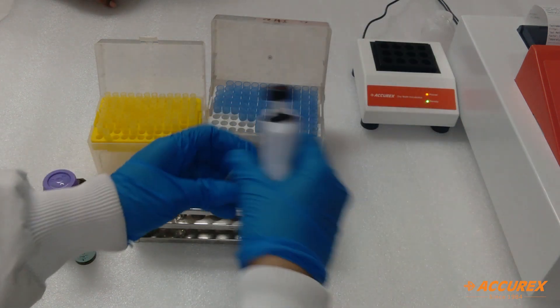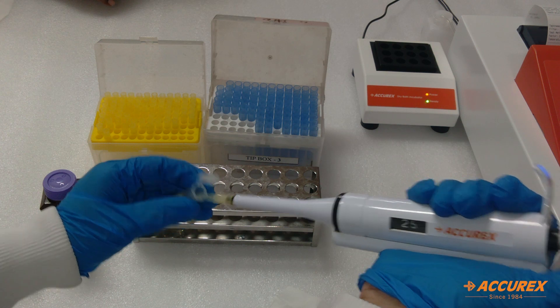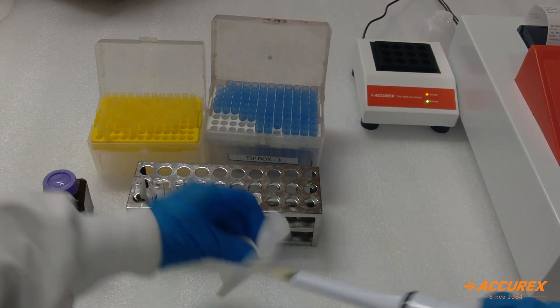Next is the serum sample. Take 25 microlitre serum, wipe with the tissue paper, and mix with the reagent properly.